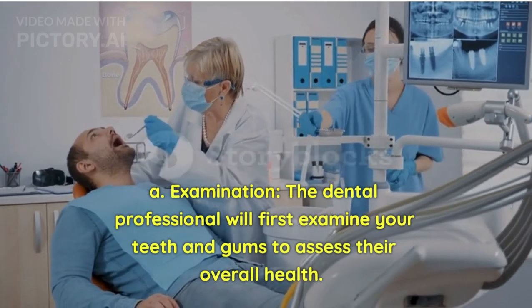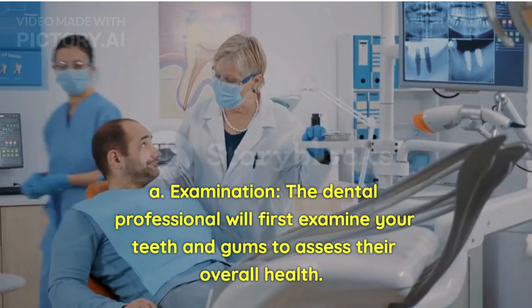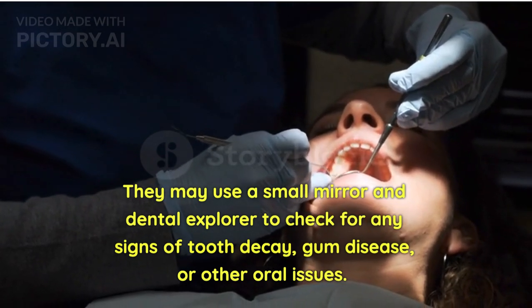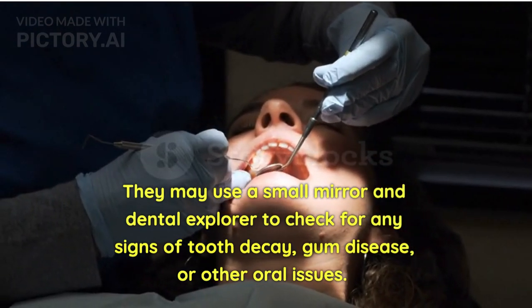Examination: The dental professional will first examine your teeth and gums to assess their overall health. They may use a small mirror and dental explorer to check for any signs of tooth decay, gum disease, or other oral issues.